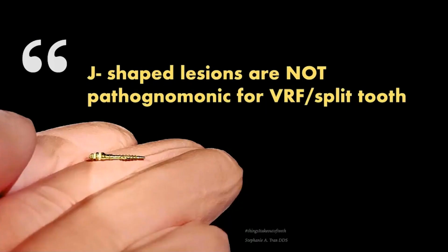Now, one of the things that we need to keep in mind, just like in that previous case, is that a J-shaped lesion, what seems to be a J-shaped lesion, is not necessarily pathognomonic for a vertical root fracture or a split tooth.